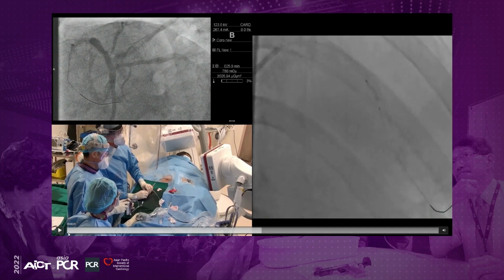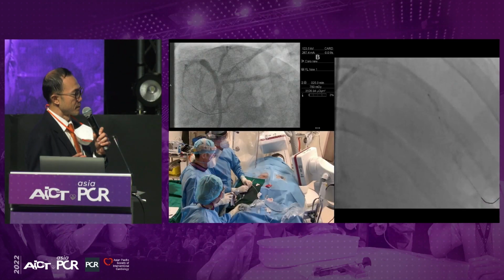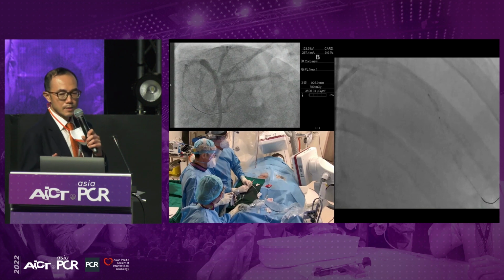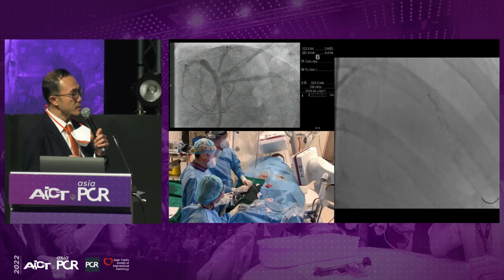The intravascular lithotripsy balloon, as you're all aware, is a very bulky balloon and is very expensive. Of course, we could use more than one, but it adds on to the cost for the patient. So what I sometimes do is to use what I think is going to be most useful in this application, and in this case it's going to be the proximal segment. We had determined on intravascular imaging that the proximal lesion is a huge vessel, 4 millimeter and more.